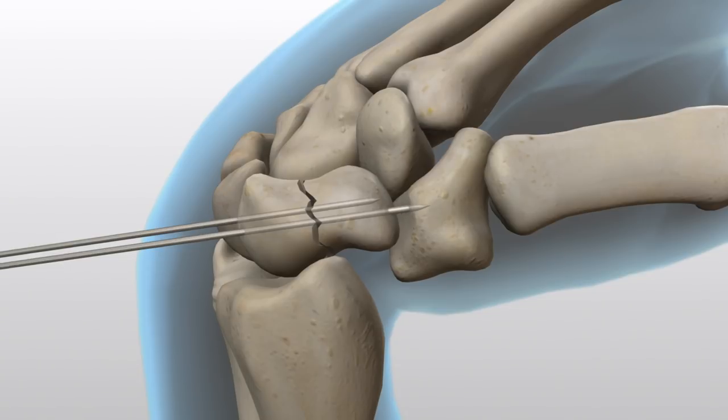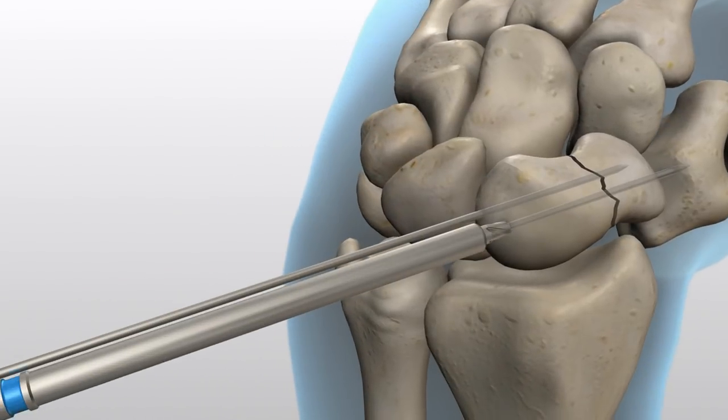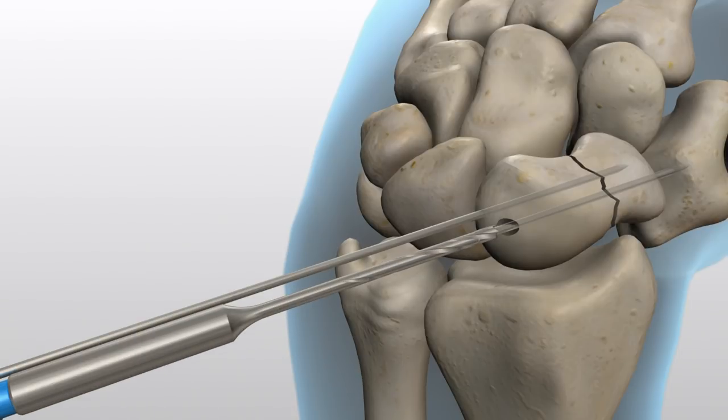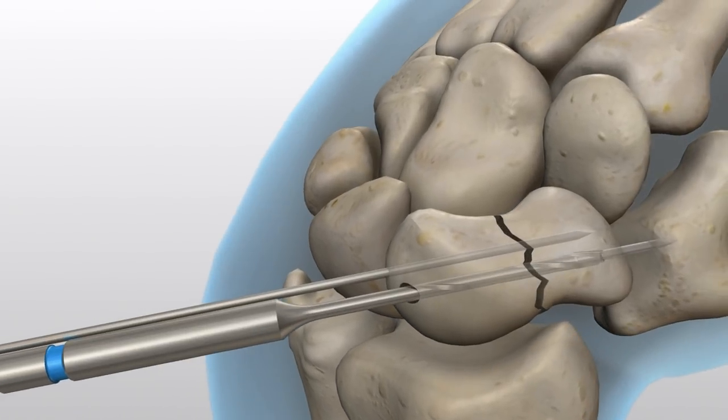Open the near cortex with the blue-banded profile drill. An optional blue-banded long 2.7-millimeter straight drill is available for use in dense bone. When using the long straight drill, make sure the guide wire has been advanced through the far cortex prior to drilling through the far cortex.